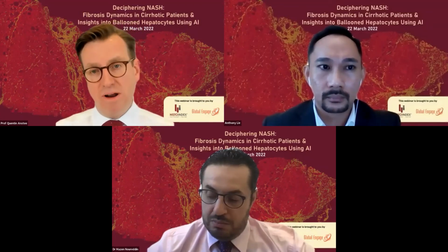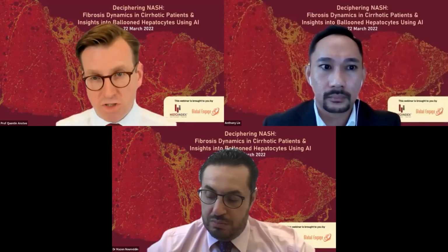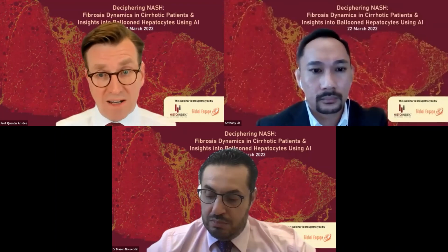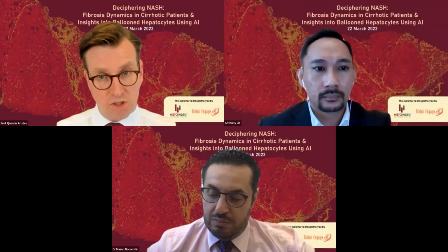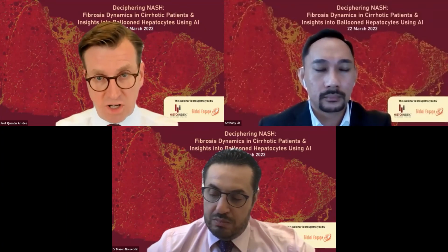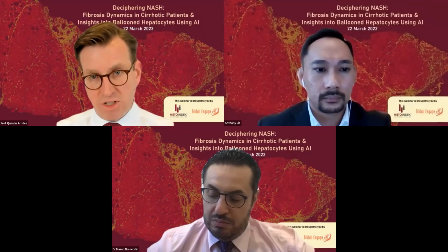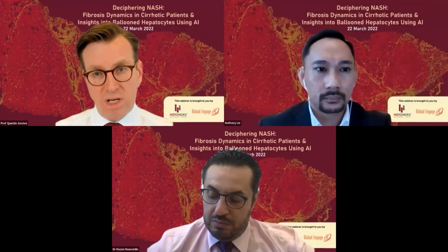And I think that's where AI comes in, because it provides a quantitative and reproducible measure that can then be used to standardize patient enrollment, not subject to inter or intra-observer variation at the start of the study, and also standardize that assessment of therapeutic response later on. And I think that would be a very helpful thing in removing some of that variation that we know impacts on clinical trials.